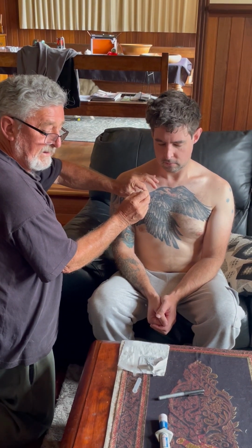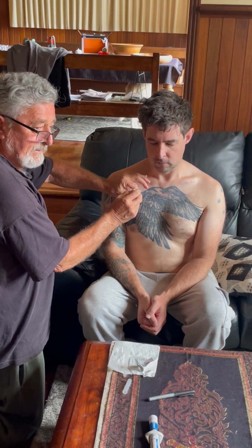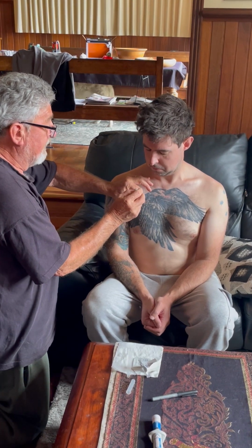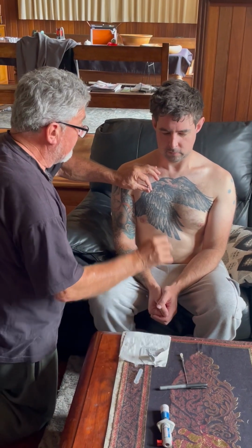Okay, we have a sharps container there. We make sure that there's nobody around, that we eyeball everybody, so sharps out. There's no risk of a needle stick injury. We take the sharp out and insert that into our sharps container.